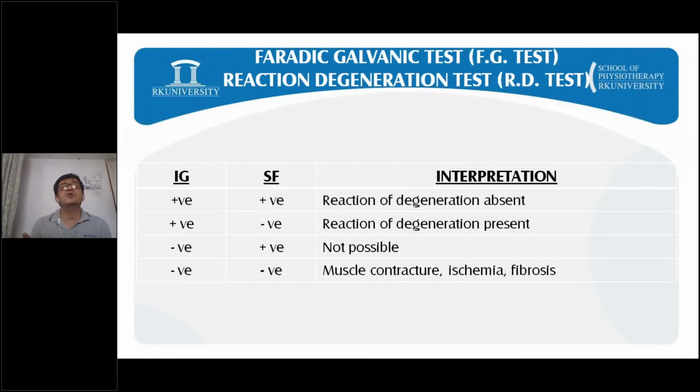So even if your wire is functioning, it's useless. Clear? So here, even if your nerve is functioning, but the tube light itself is not working in our example, it means the muscle is not working. Clear? So what is happening? Even though the nerve is functioning, the muscle is not functioning, so there will not be a response. Clear? So actually the third probability is not possible.